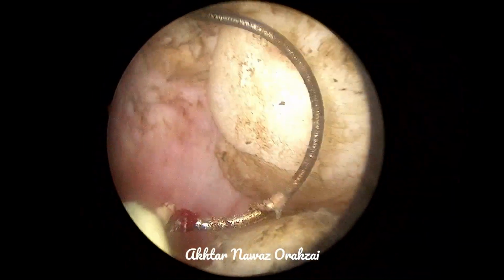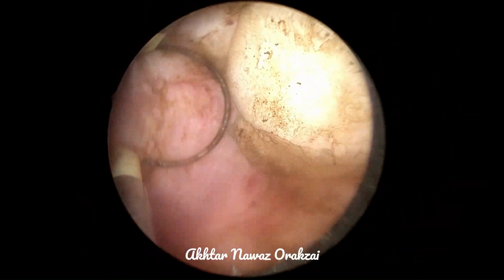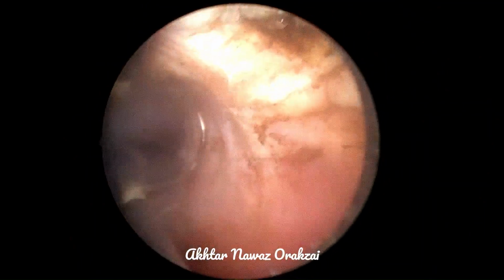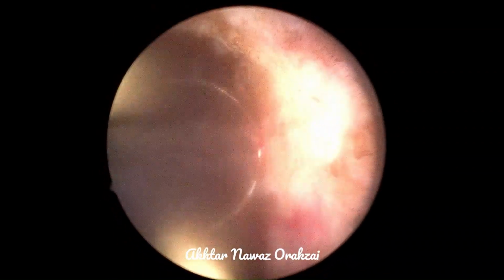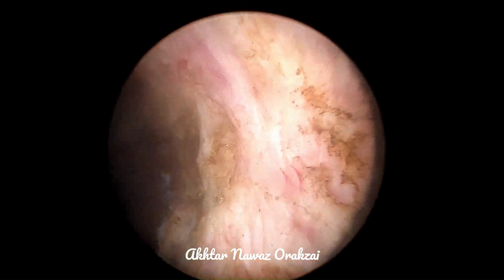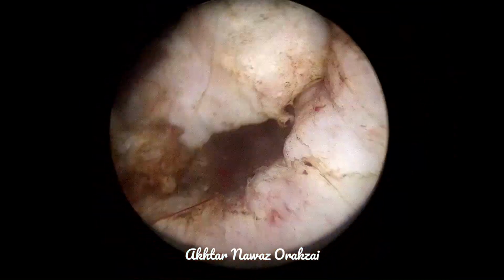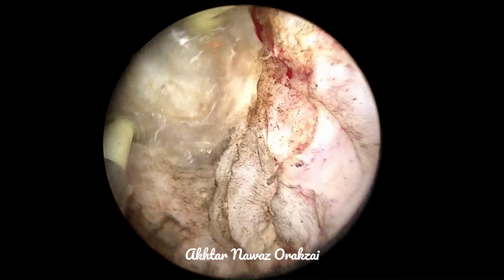In this particular case, once again, I have to remind you that this is a younger patient who is sexually active. So our intention is to make him symptom free and at the same time preserve his erectile function as well as prevent retrograde ejaculation. So we will not be resecting a lot of prostate here.